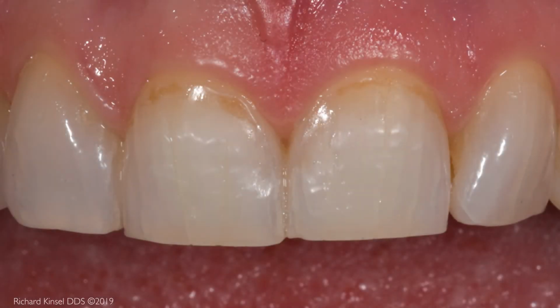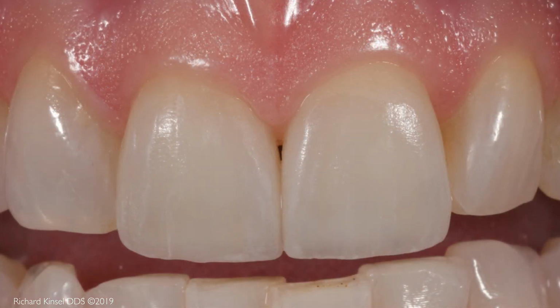Porcelain veneers can also restore the original length for teeth that have been worn down. This is the new appearance after bonding two porcelain veneers to the central incisor teeth. A night guard is recommended during sleep to protect the veneers.